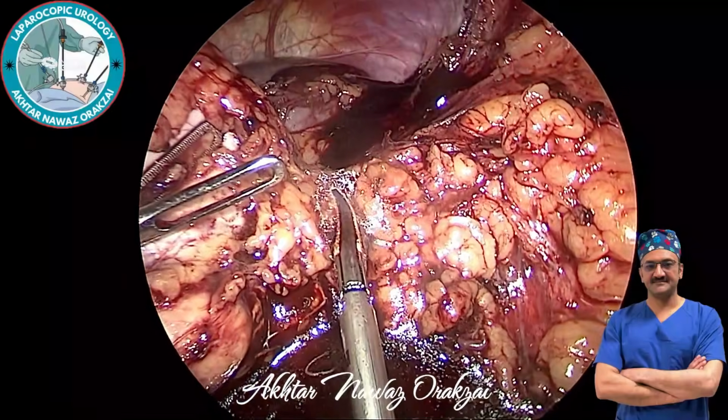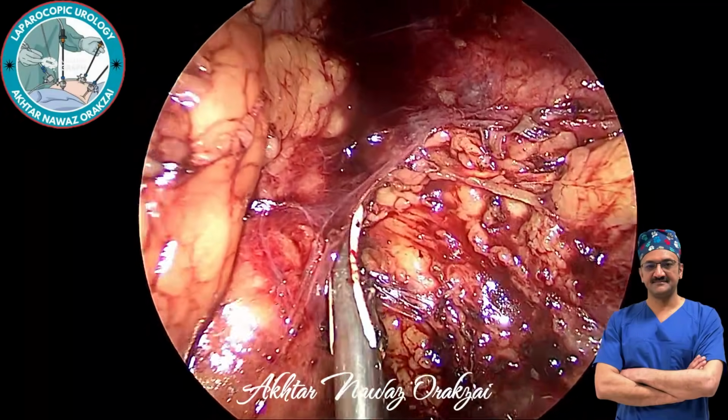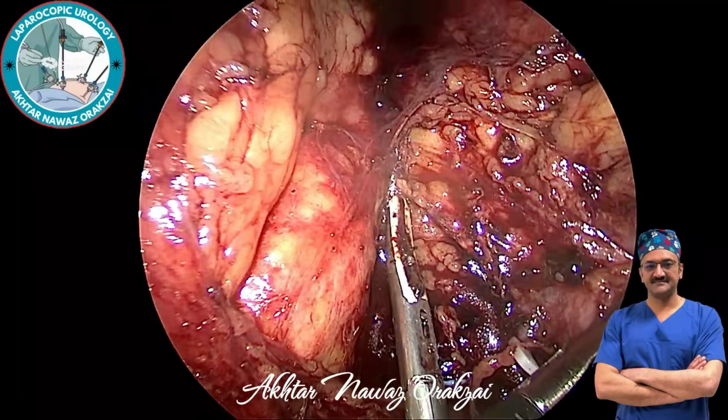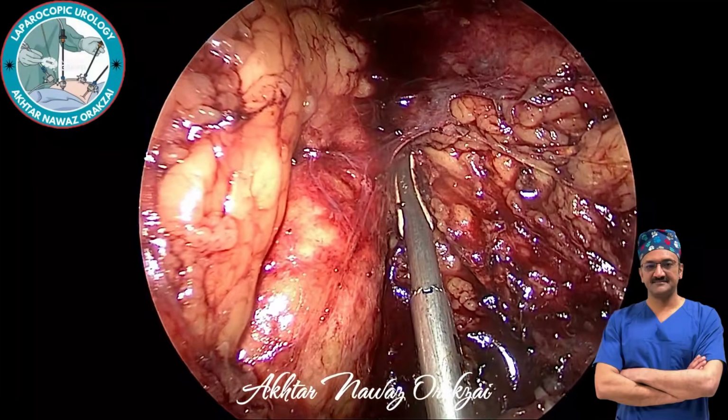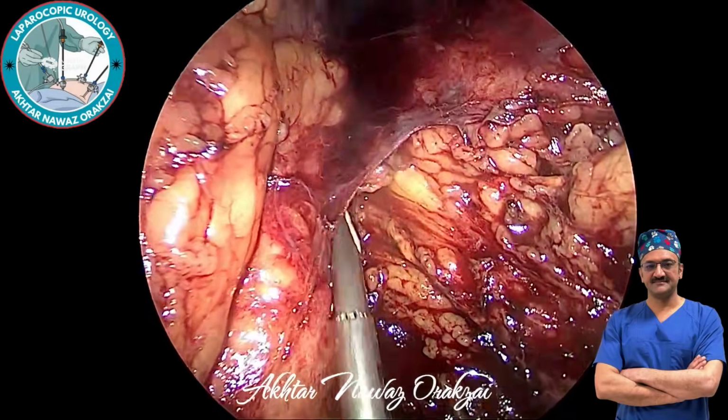But here, if there is anything, you can control it easily. So personally, I feel that left adrenalectomy is easier.